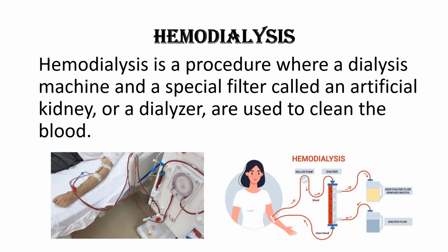Hemodialysis is a life-saving treatment for an individual with end-stage renal disease or acute kidney injury who requires renal replacement therapy. It is usually performed in a dialysis center or a hospital, but can also be done at home with the proper training and equipment.